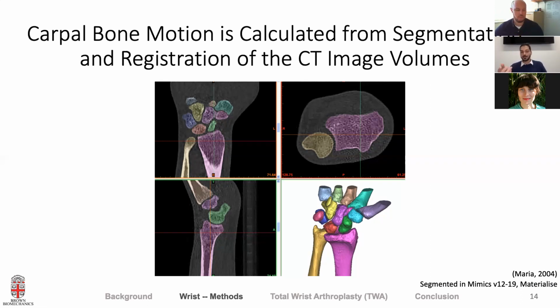But it's a little bit more complicated than that, and the mathematical equations are. But it hinges on essentially the volume being preserved and the tissues being more or less rigid. I don't know if there's a shape component or if it's just pure volume. It's pure volume, but exactly, it completely depends on the bone not changing, the shape is preserved.